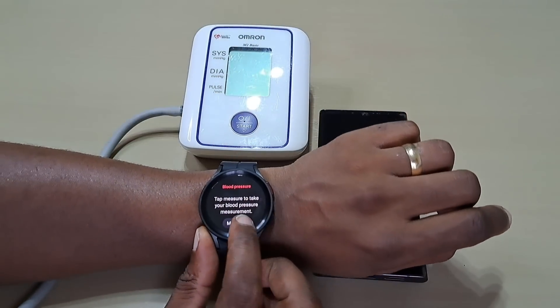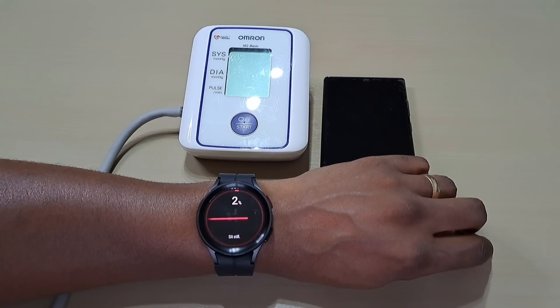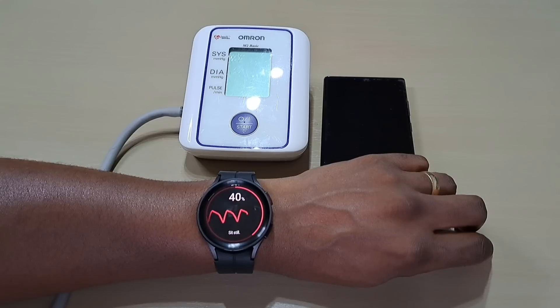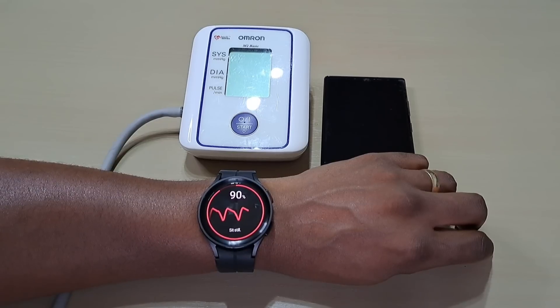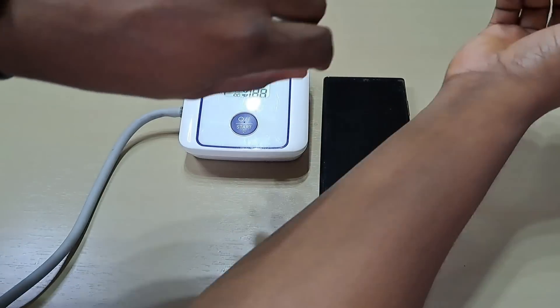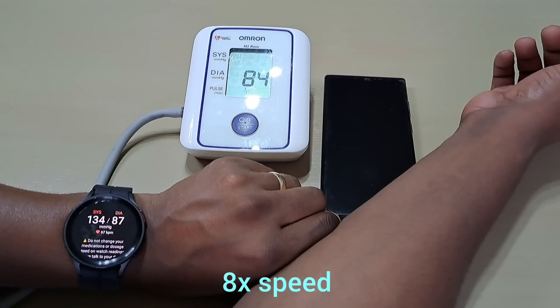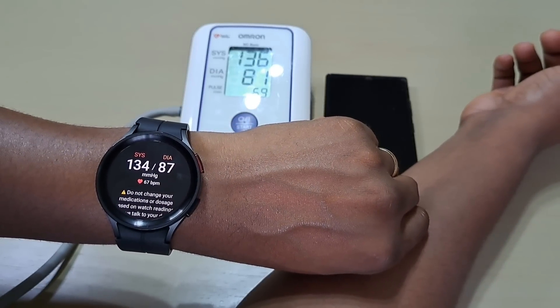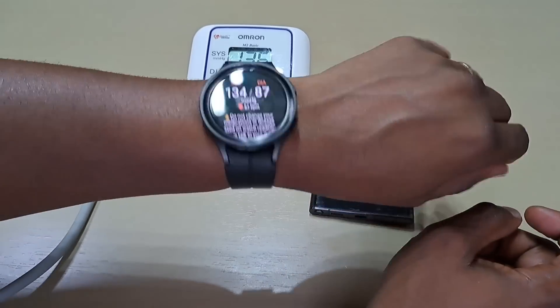Right now, measure on the watch. Let's try the blood pressure quickly. And that's the reading. Right guys, that's how you calibrate the watch with the blood pressure monitor. So now it's all set up to take your blood pressure.